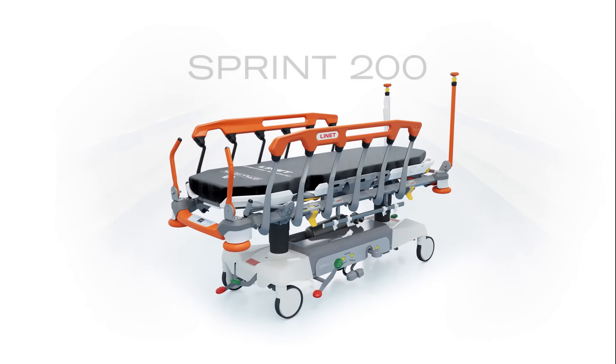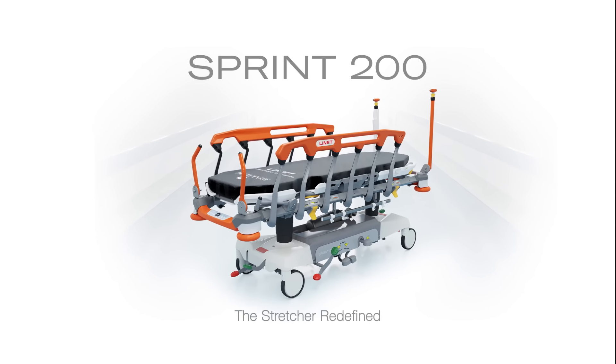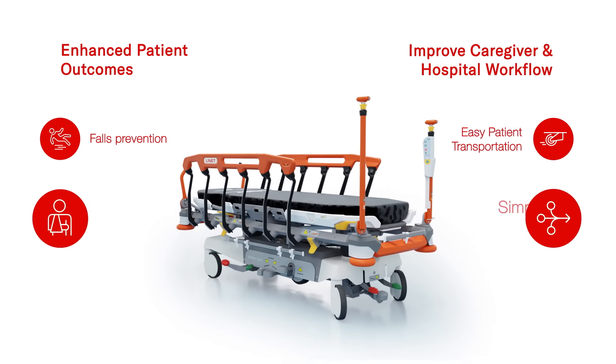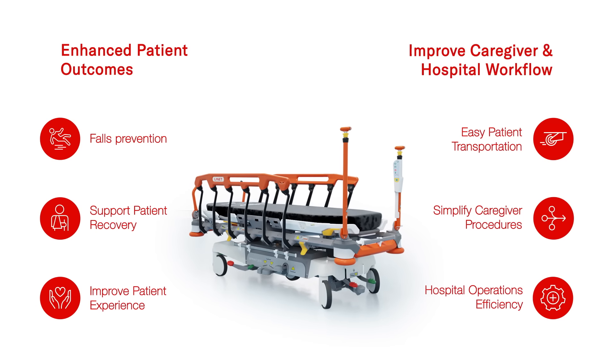Introducing Sprint by Linet — the stretcher redefined. Let's see how the Sprint 200 can help with improving caregiver and hospital workflow and enhancing patient outcomes.